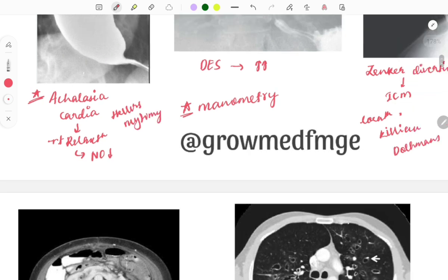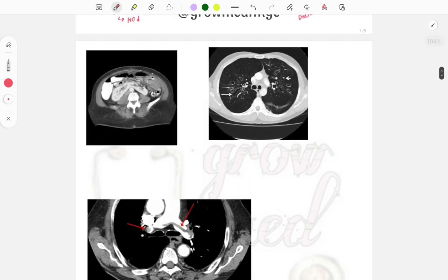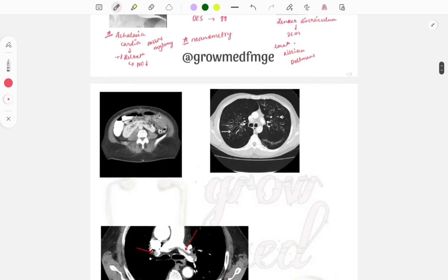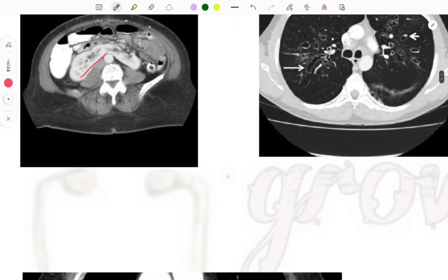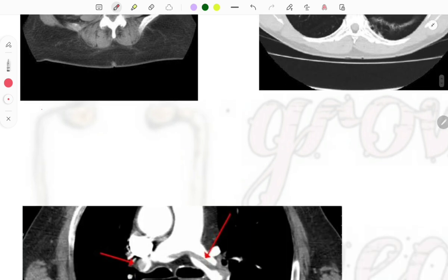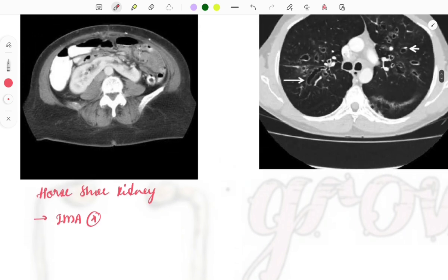Those were the important esophageal barium swallow diseases. Next is the famous horseshoe kidney image — the kidney appears horseshoe-shaped. This occurs due to abnormal ascent, where the inferior mesenteric artery prevents the kidney from traveling upward. Horseshoe kidney is most commonly seen in male children.